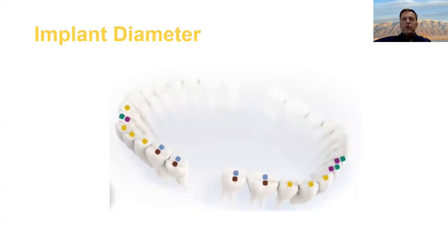The other thing is that we want to get really good emergence profiles. We've all seen the lollipop on a stick crown, where we've got a little tiny implant and a big old crown on it. And it is impossible to get really good hygiene on those cases, in my opinion. So we don't want that. We want to think about, can I put an implant in that is similar in size to the root of the tooth that was missing?